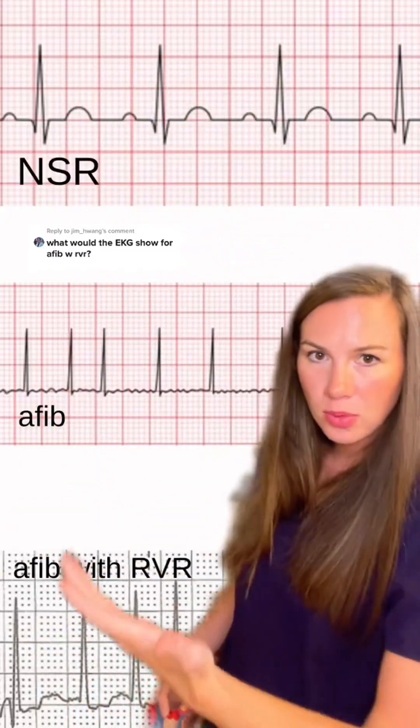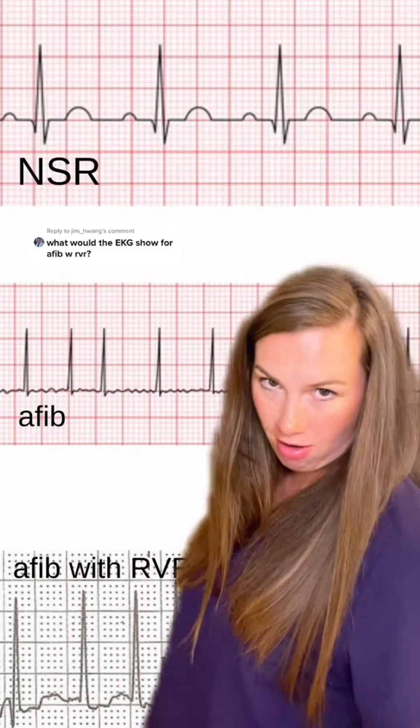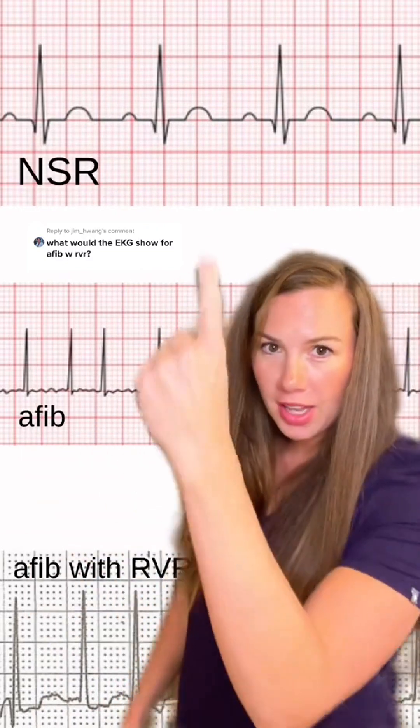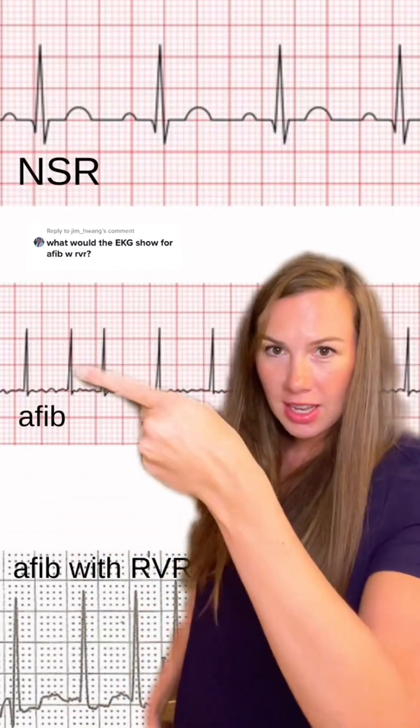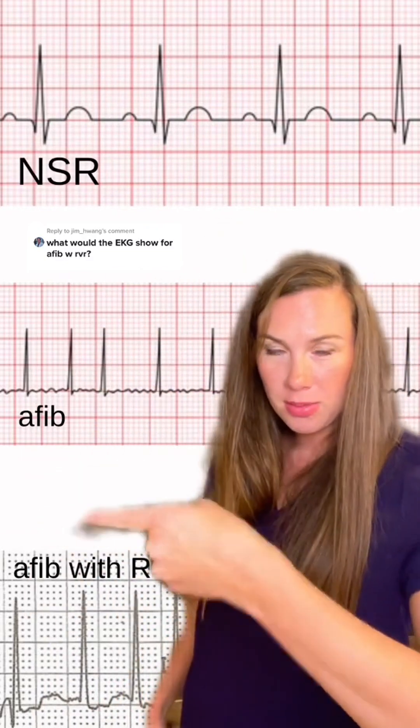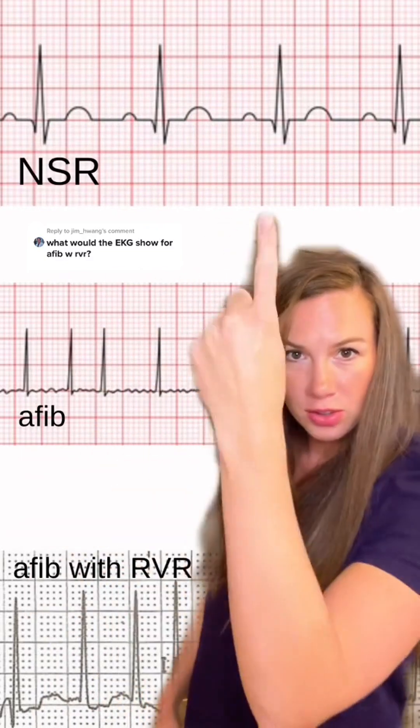Let's show what AFib with RVR looks like on an EKG and compare it to normal sinus rhythm. Here are some rhythms: we've got normal sinus, AFib, and AFib with RVR.